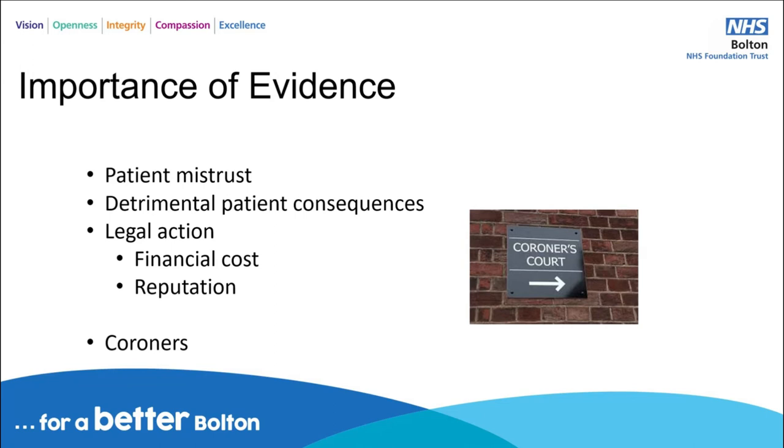And it's also important to have evidence for legal action, because you're never aware of when there's going to be legal action against the organisation with regards to problems or issues. And one of my fears more than anything else is not necessarily legal action, but it's having to answer for the things that we've done or are doing in the laboratory, and the standards of our tests, in a coroner's court.